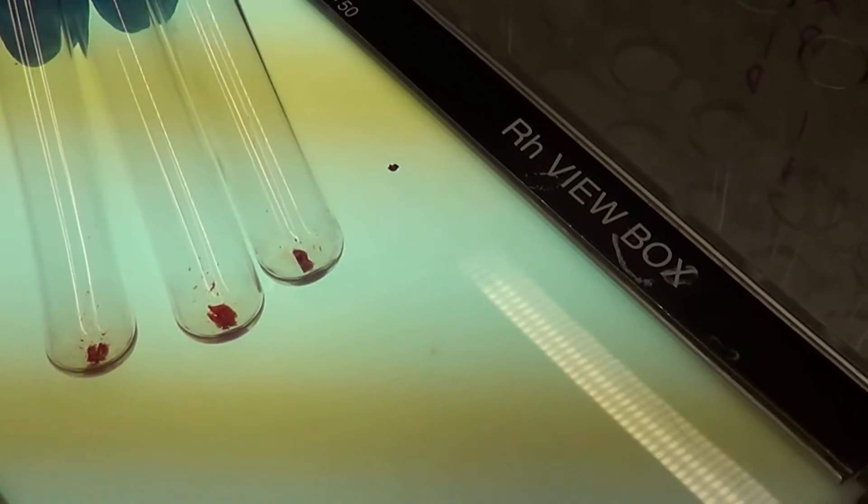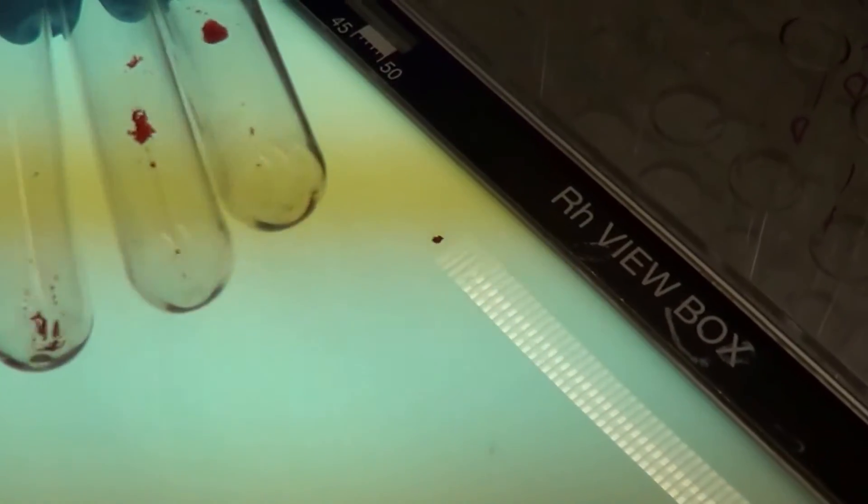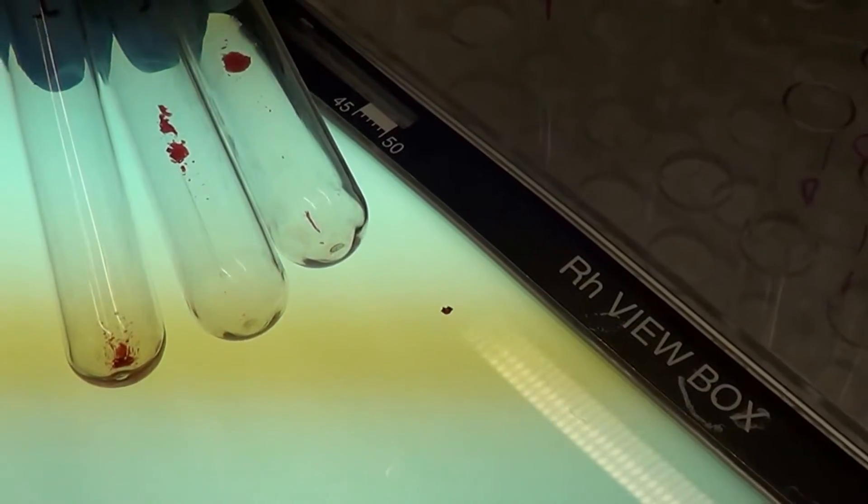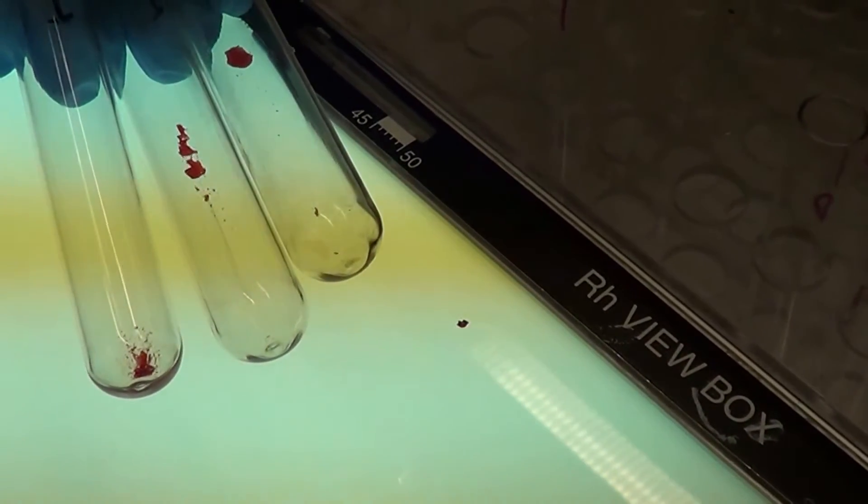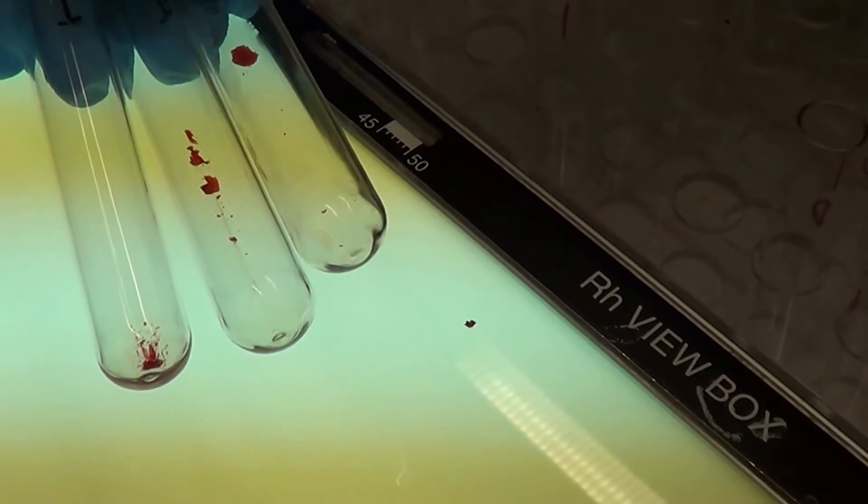This is a positive reaction. You can see the agglutination in the test tubes. That means this patient has antibodies to red cell antigens and we would have to investigate to determine what it is.